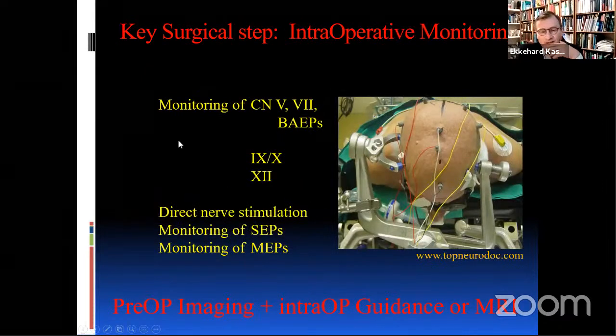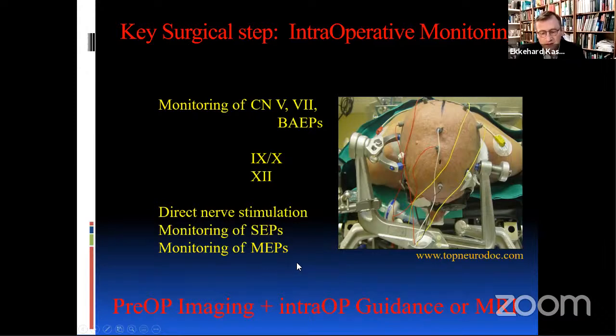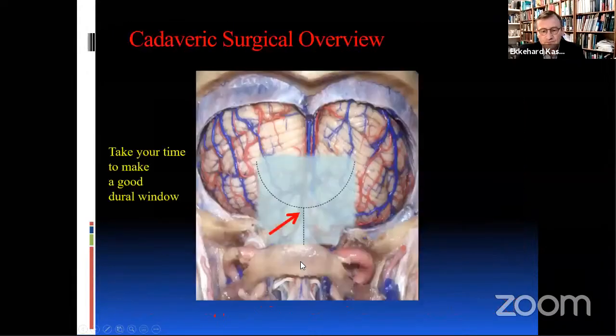This is another step that I consider key for intraoperative monitoring. I monitor all cranial nerves. I do direct nerve stimulation. I use sensory evoked potentials and monitoring of MEPs. That gives you surgical sensitivity that you're not pulling too hard.